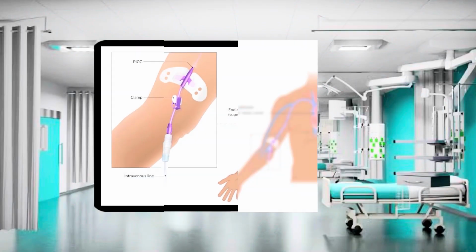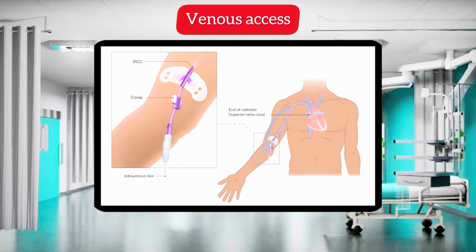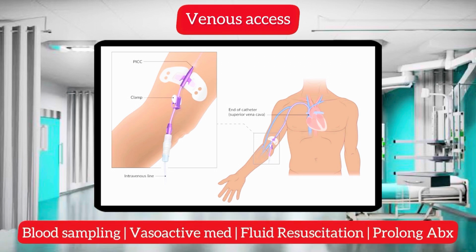The ability to obtain venous access in the inpatient and outpatient setting is one of the most fundamental, yet crucial components for a large number of diagnostic and therapeutic interventions. It is especially vital for critically ill patients who often require frequent blood sampling, vasoactive medications, rapid fluid resuscitation, prolonged antibiotic administration, and various other indications.